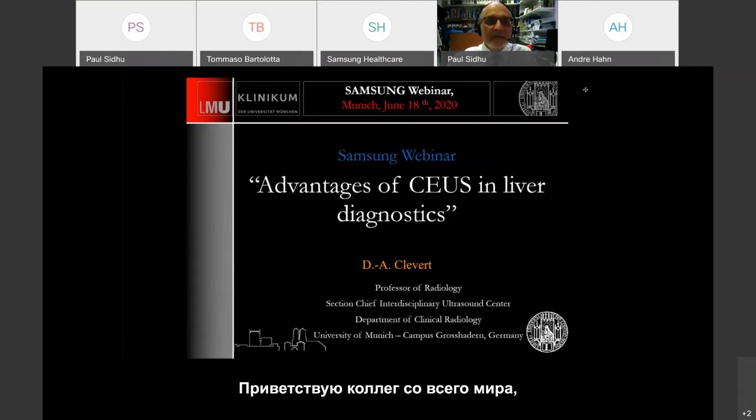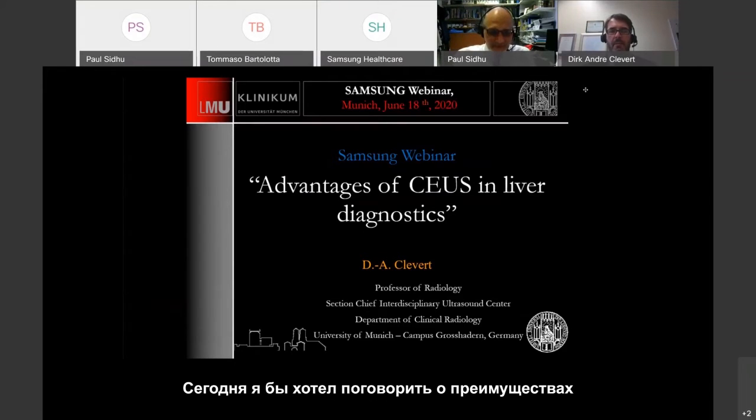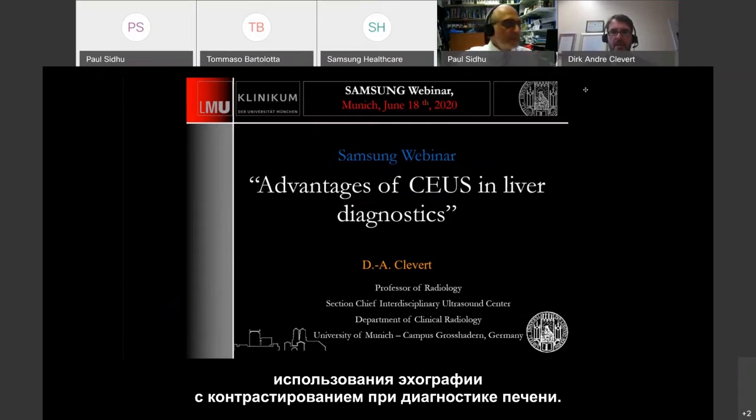To all the other colleagues from the world, so should I say good morning, good afternoon, or good evening. Today I would like to speak about the advantage of contrast ultrasound in liver diagnostics.